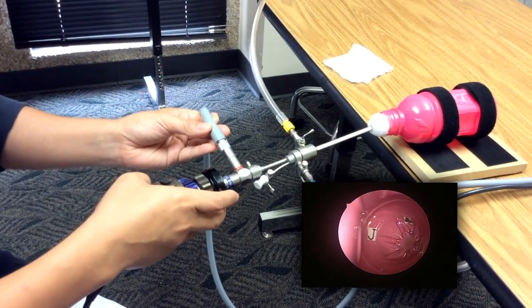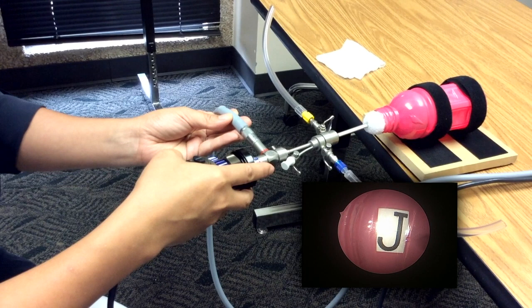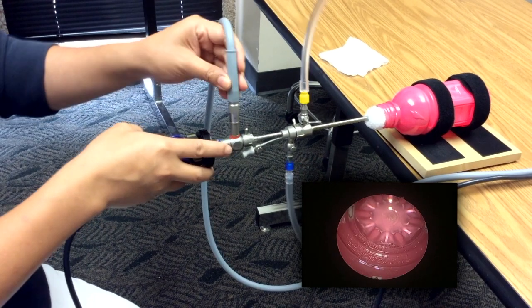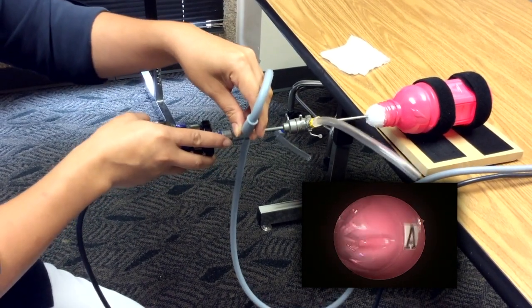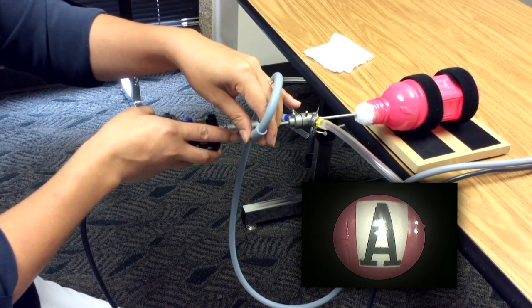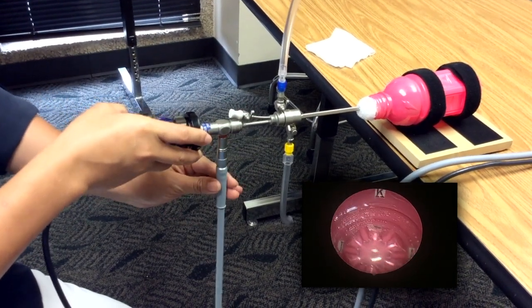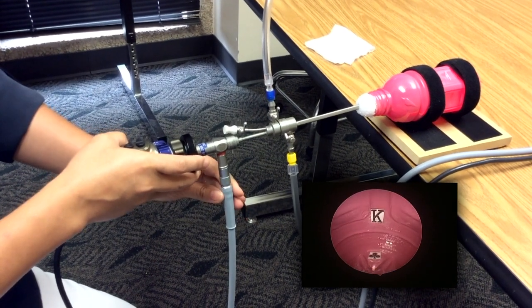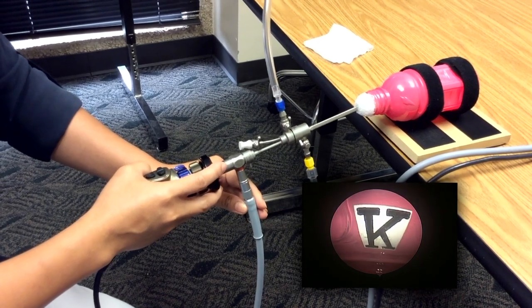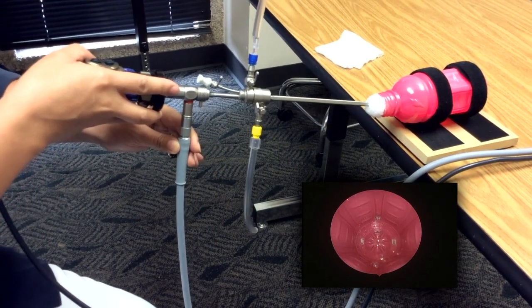Swing the light cord to the left to see the J, which represents your patient's right tubal ostium. And swing it into the opposite direction to focus on the A, which represents the patient's left tubal ostium. Now move the light cord to face down in order to look up, and focus on the K, representing the anterior wall of the fundus. Back the hysteroscope out, and get another global view and remove the scope.